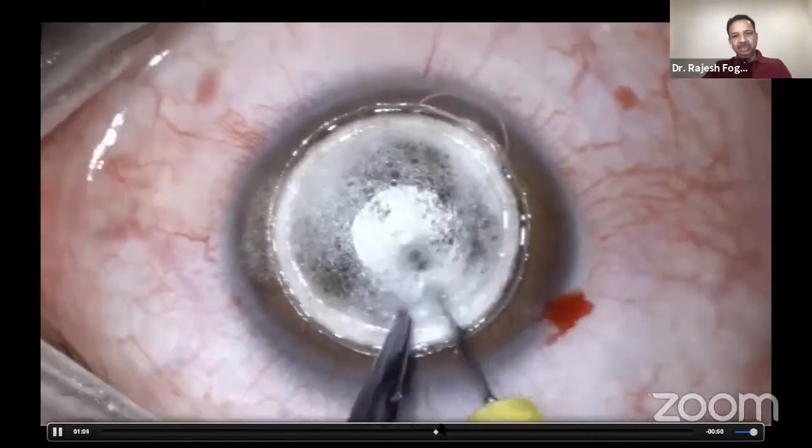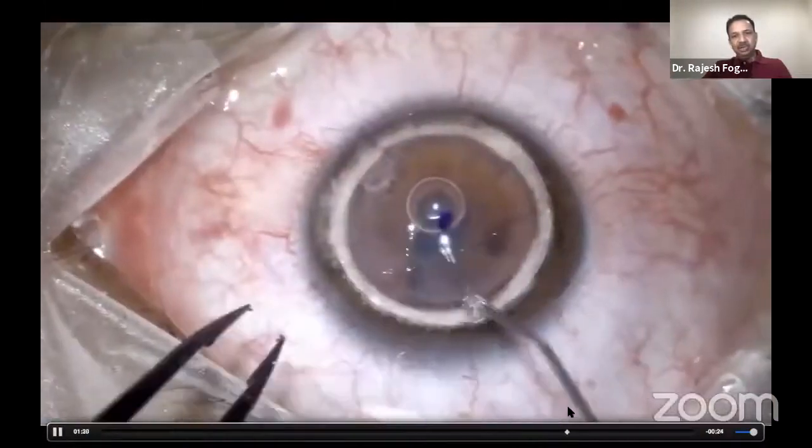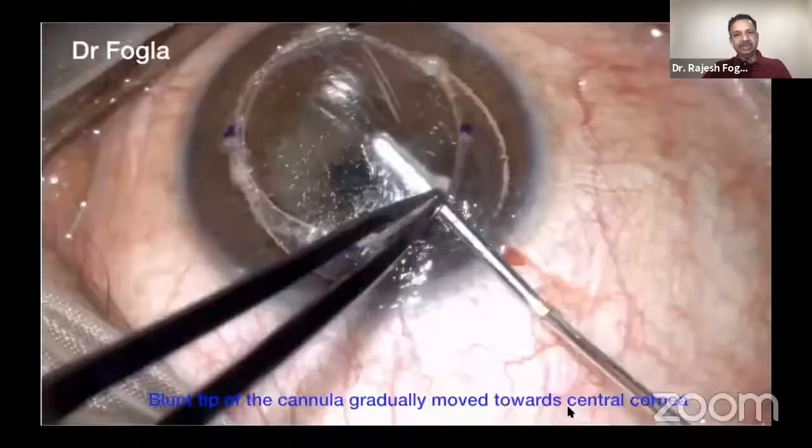Do the bubble test, put in some viscoelastic, deflate the bubble, and then you can excise the stroma, put in your graft, and secure it with interrupted sutures.